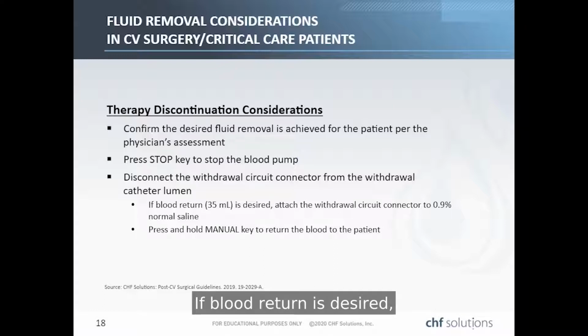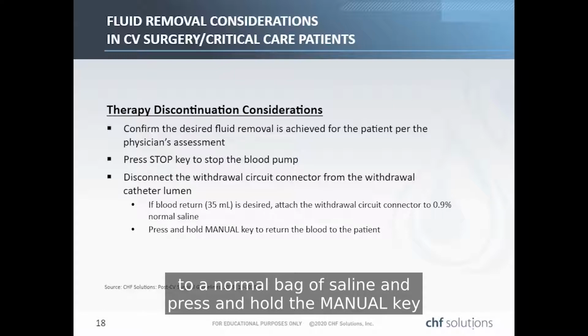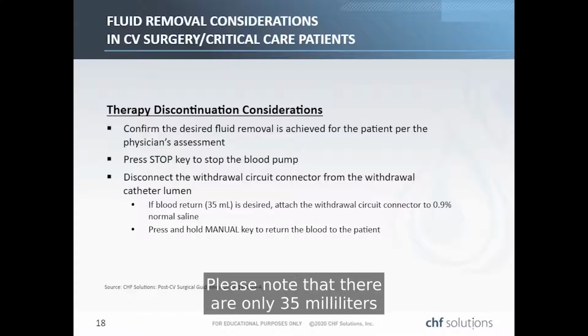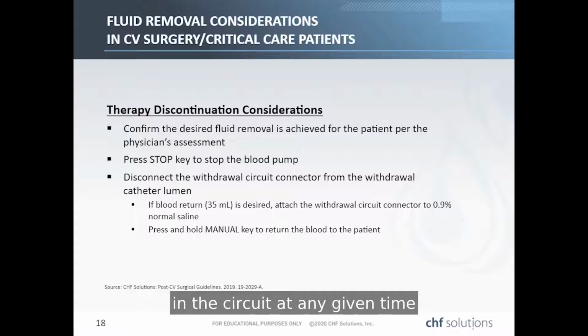If blood return is desired, attach the withdrawal circuit connector to a normal bag of saline and press and hold the manual key to return the blood to the patient while filling the circuit with saline. Please note that there are only 35 milliliters in the circuit at any given time, and thus blood return is not required.